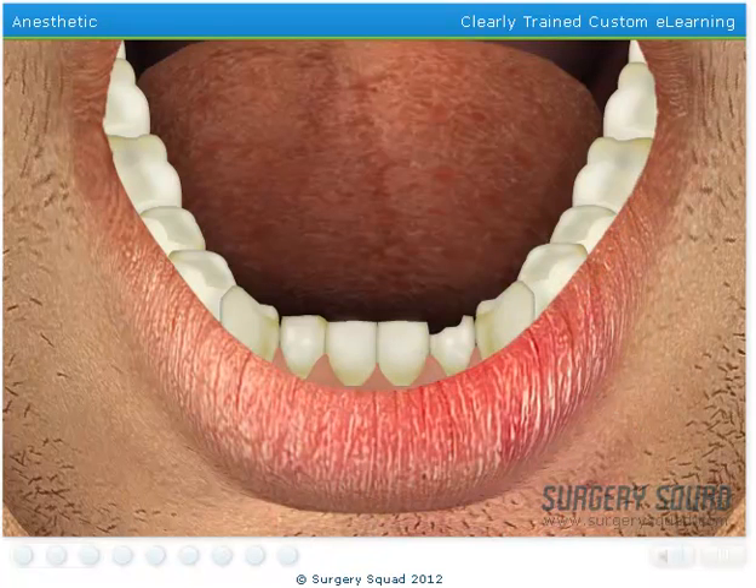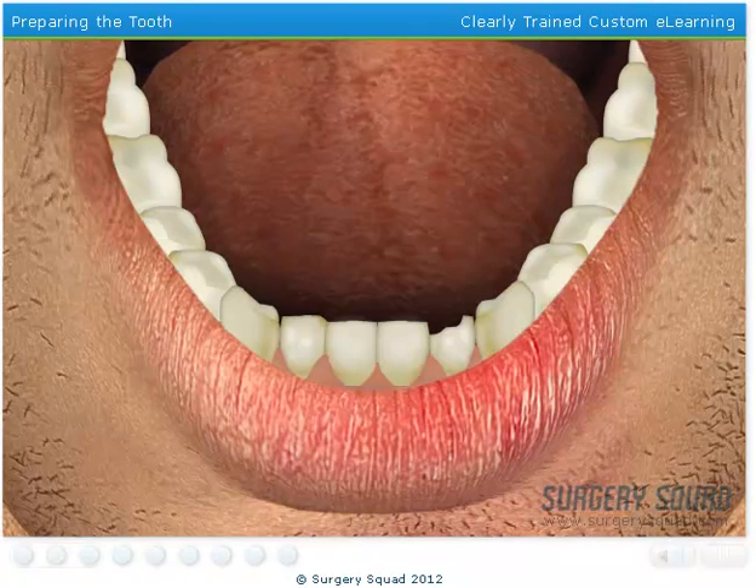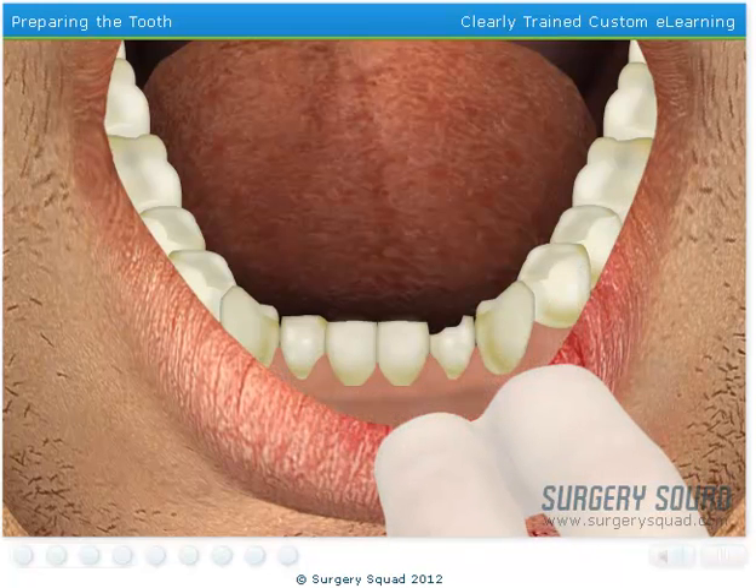Let's wait a few minutes to allow the anesthetic to set in. Now that the area has become completely numb, we can move on to preparing the tooth. To begin, we'll reduce the size of the tooth, cutting it away from the adjacent teeth.